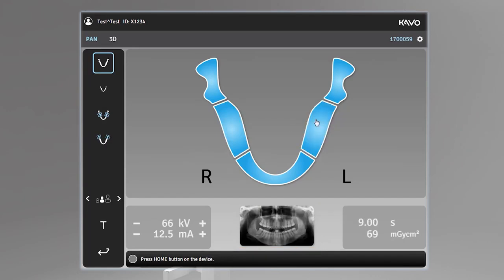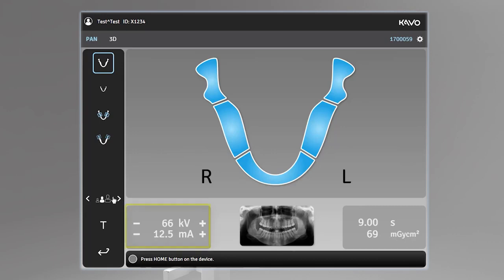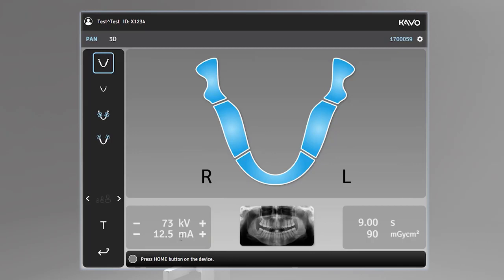The patient size indicates the currently selected patient size. Press the patient size selection icon to open a list of patient sizes: small, medium, and large. Select the patient size icon to activate it. Selecting a patient size adjusts the KV and MA to preset levels. Manually adjusting KV and MA according to the patient size and skull anatomy is also an option, accomplished by selecting the minus and plus icons.